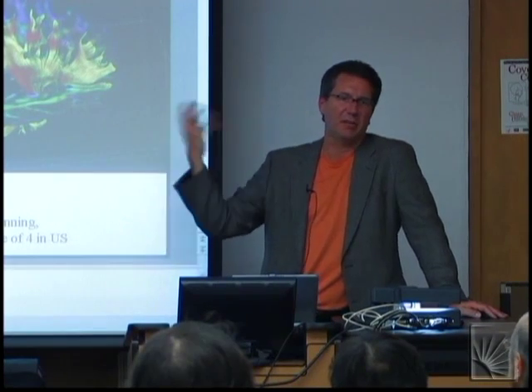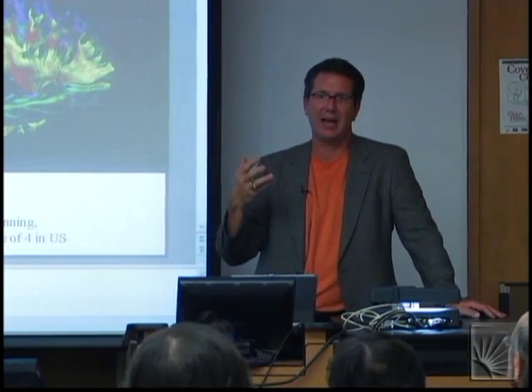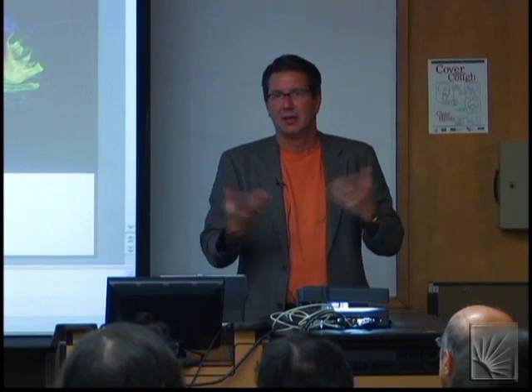Now with this technology, you don't have to hook them up to an ECG. They don't have to hold their breath. You just image as fast as you can and get the data. The reconstruction can take longer in that application. The real-time part isn't as important because we have the data. But again, there are going to be a number of applications where computer science has tremendous implications for what we can do in healthcare.